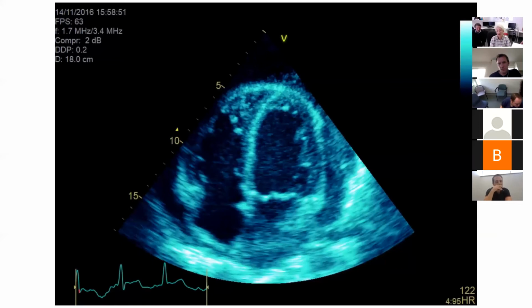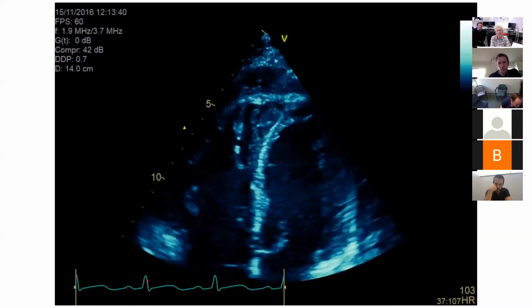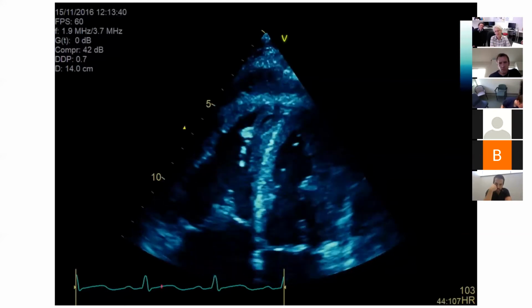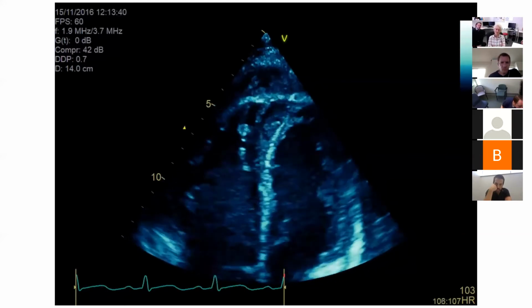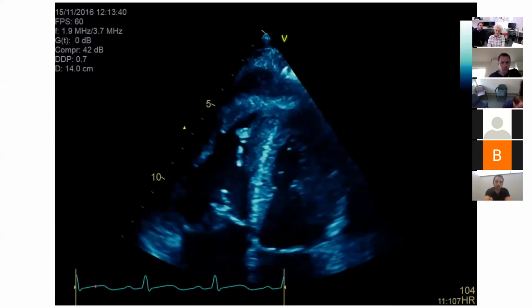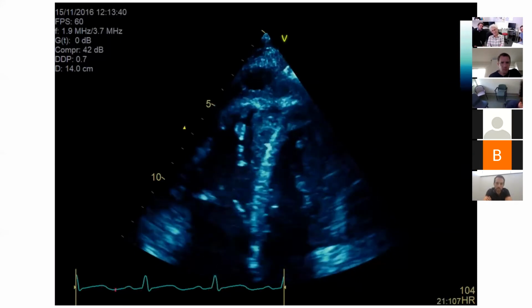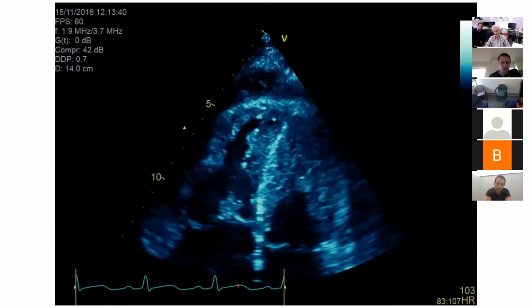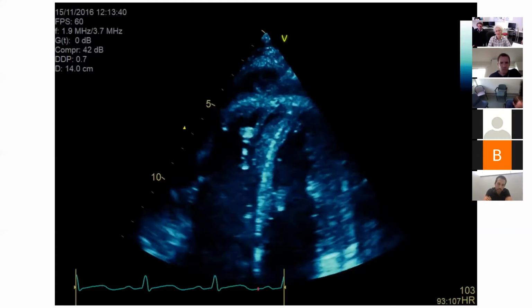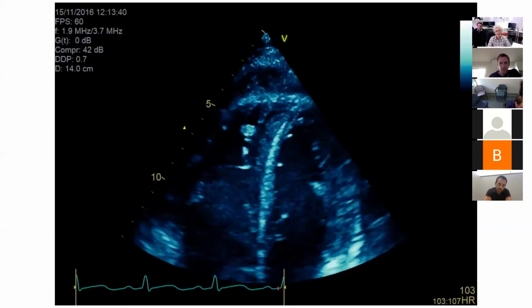All right. Moving on to the next one. So this is just a close-up. I think it was actually more to look at the right ventricular wall. Lee, what do you think? As in the right ventricular free wall. Yeah. It still seems to be contracting all right. I wouldn't measure how thick it is from this angle. The atrioventricular valve seems to be opening and closing all right. And there seems to be less noticeable septal bowing at this view.